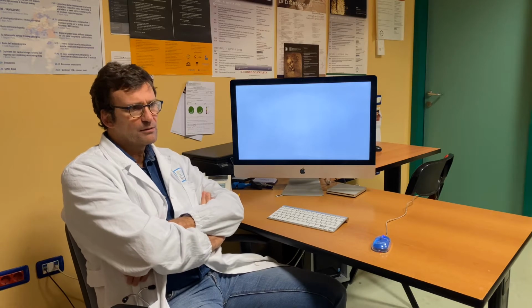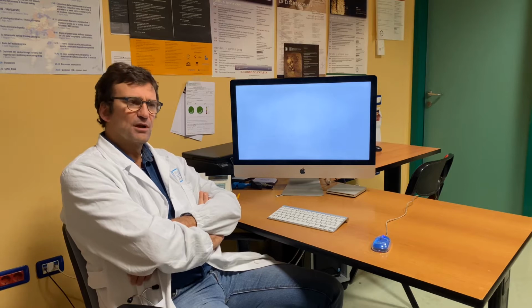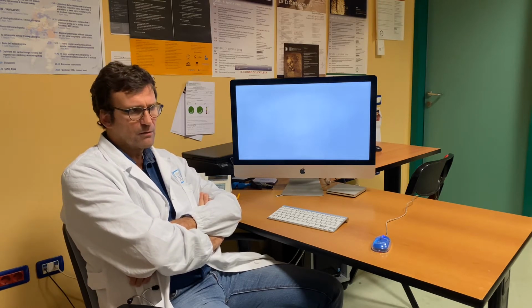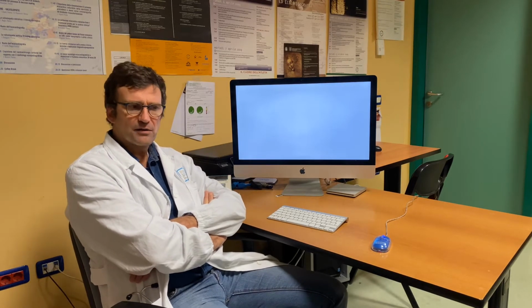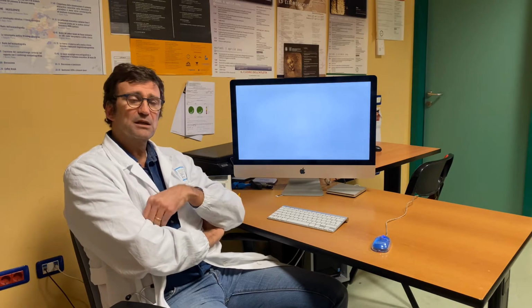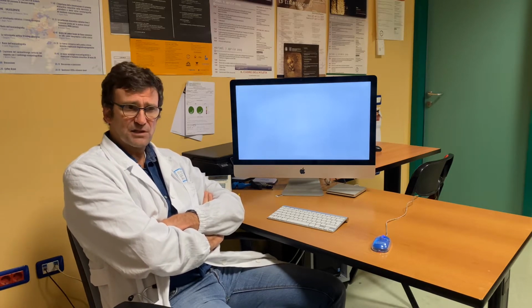Sure, well, they're probably underused. Contrast helps a lot in echocardiography in general, not only during stress echo. Contrast helps you see better when you have suboptimal images. For example, the use of very low mechanical index imaging helps a lot in that it puts together perfusion and wall motion, and so it may highlight defects that you may not see without contrast.